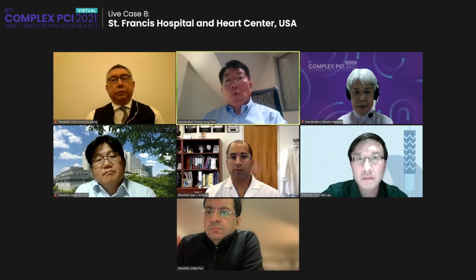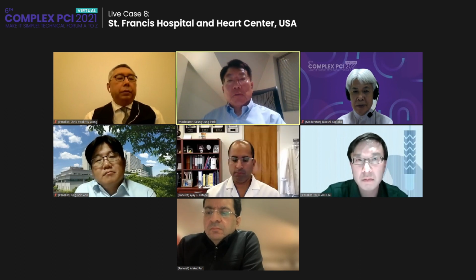Okay, what about Dr. Wong? So you have a lot of experience. Yeah. Less than 10%, basically. But in our lab, we tend to use a simple balloon technique if possible.